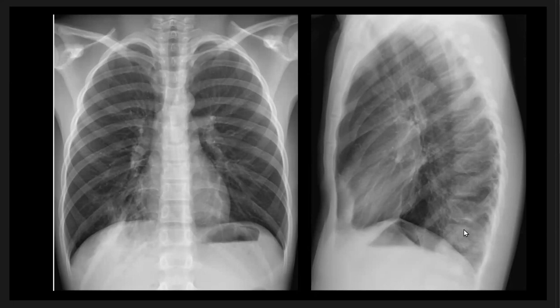The vertebral body and the rest of the lungs appear clear. The costophrenic angles are unremarkable and the bone cage of the chest is unremarkable. The final diagnosis for this patient is mycoplasma pneumonia. As we learn from this case, there is an infiltration on the right lung partially obscuring the diaphragm, and this is one of the hidden areas in the chest X-ray.